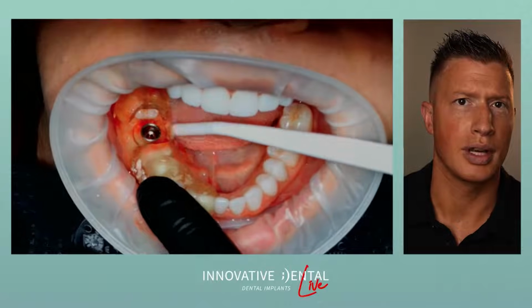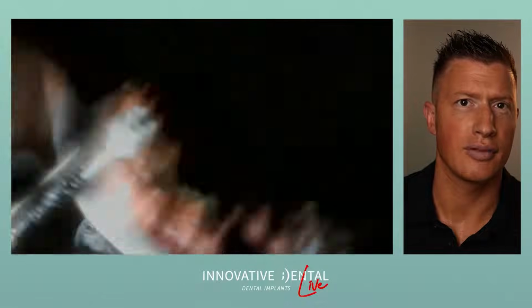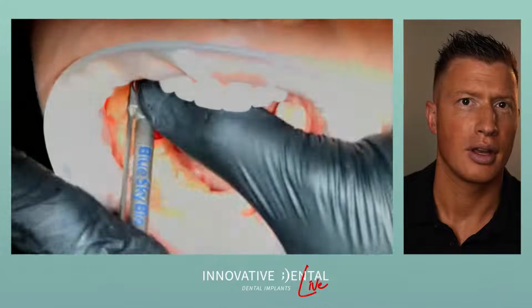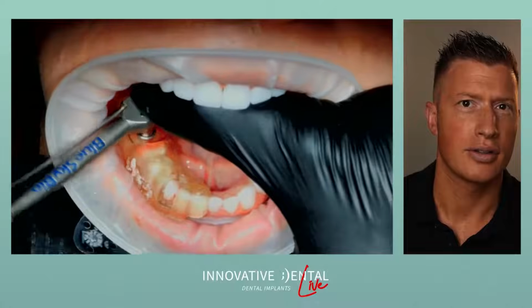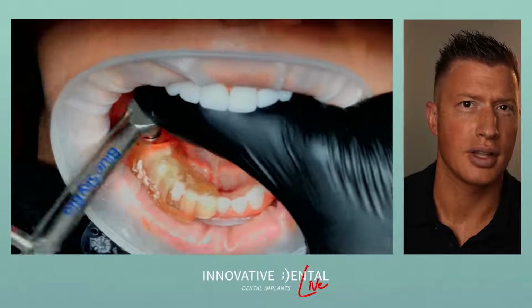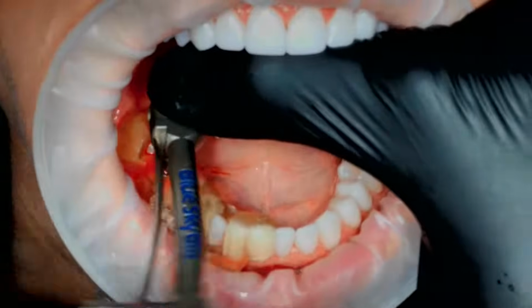And this torque wrench is what really is going to help us guide it perfectly straight and flush to the proper depth. And there we go. Get my head out of the way. That's what I'm doing right there. So that torque wrench allows me to do that. Guide it right down. There's a line on that torque wrench.